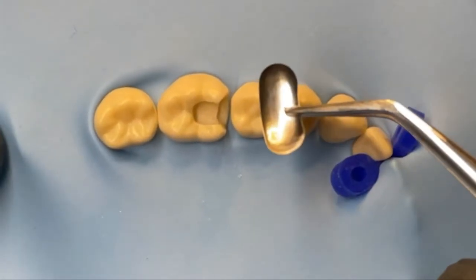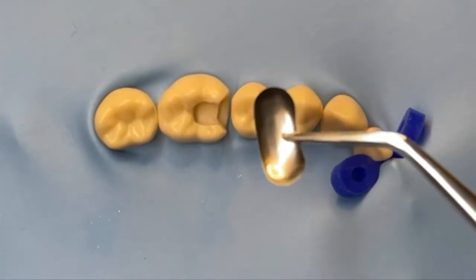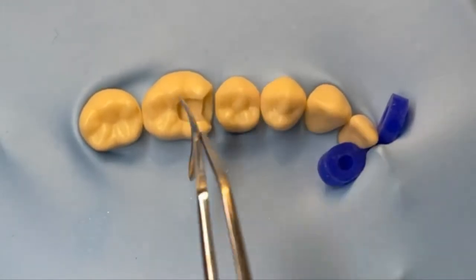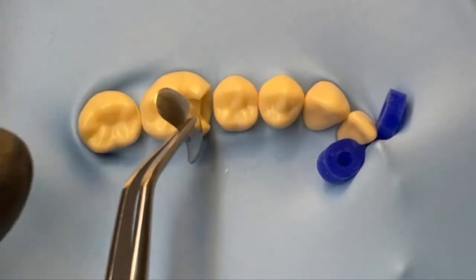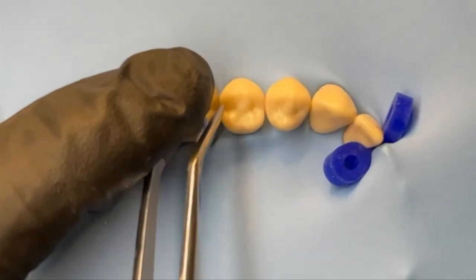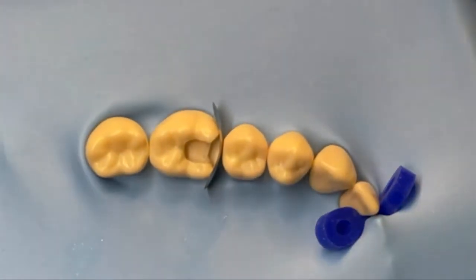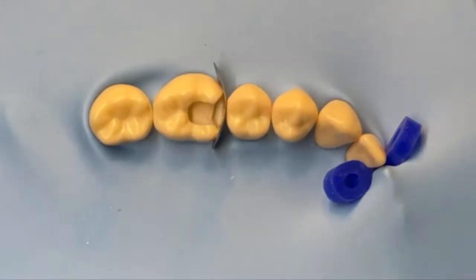Coming back to our class two cavity - we're going to use a medium band. Use a perioprobe to measure from the base of the cavity up to gauge the band size needed, wanting it about 1 to 2 millimeters above the margin. You want to place the band without deforming the matrix - that's key to keeping the contact profile. You can slide it from the inside ledge down, or bring it in from the buccal. Using tweezers, come from the occlusal and roll it down without creating any deformation. It's easier with these hardened steel bands - look at that gorgeous anatomical profile.